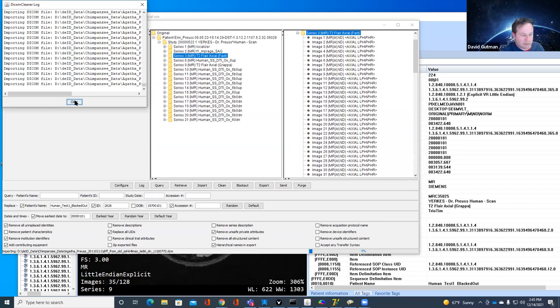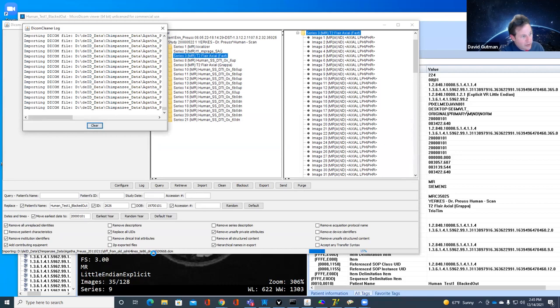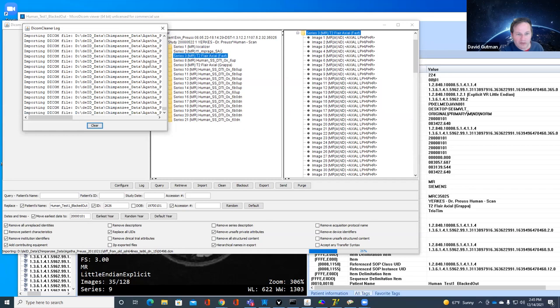Now I'm going to de-identify a chimpanzee dataset. This one has a DTI scan, so there are thousands of images. That's one of the advantages of using NIfTI — it usually produces one file per series, whereas DICOM produces lots and lots of files. If you ever try to FTP your entire image repository with several million DICOM files in it, you'll know some of the pain of transferring lots and lots of small files.